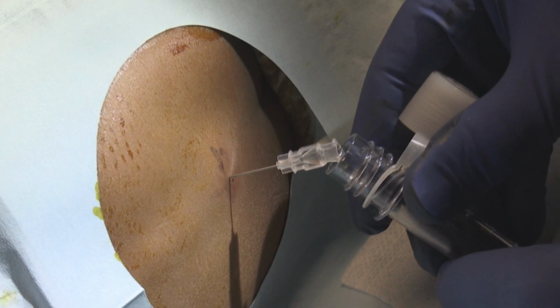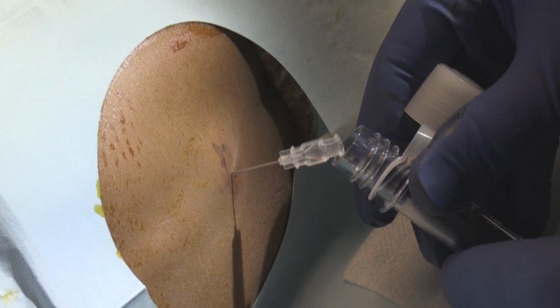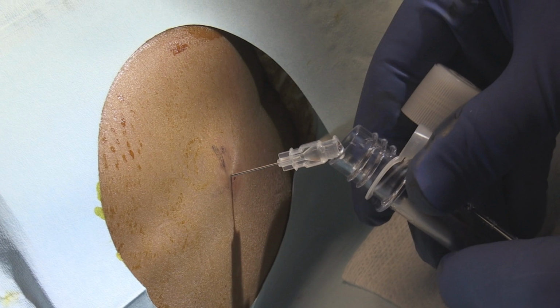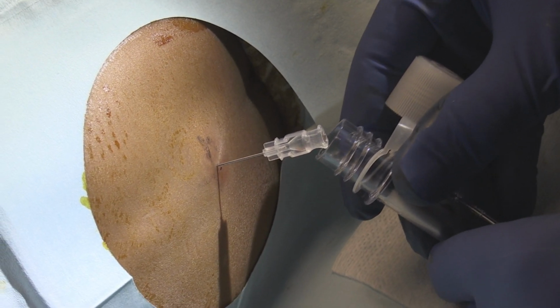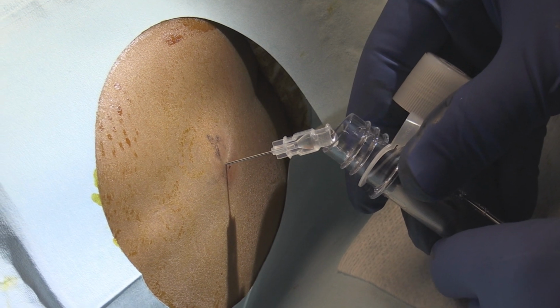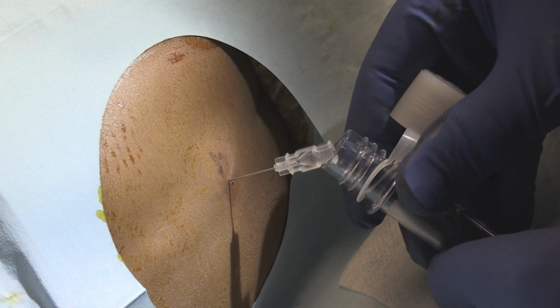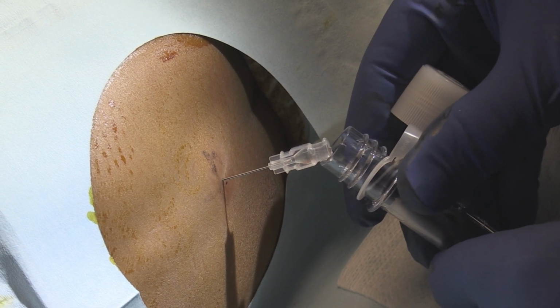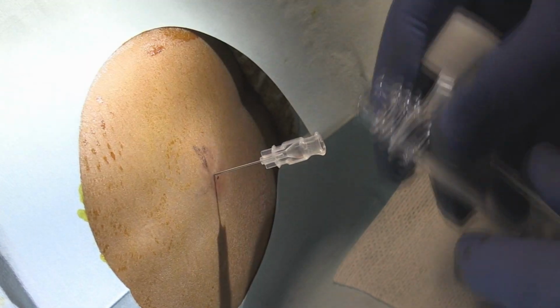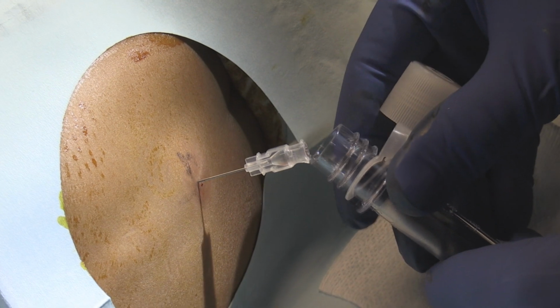But you notice though, I numbed him up. Most people, especially on the neonates, don't think you need to numb them up. I think it makes a big difference. And the literature actually says that you have more success if you numb them up. And they move less. Yeah, you notice that.